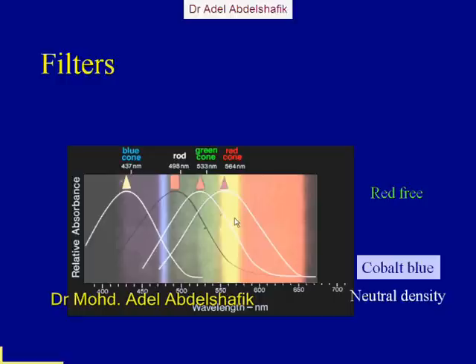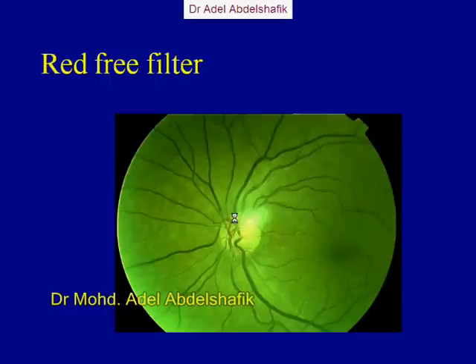We've learned that if you stay in a garden and you start to see the colors of the plants and flowers while the sun is going away, then the colors change when the amount of illumination is less. Things like a red rose, just before absence of light, will be brownish or dark. So this is the same. If you minimize the illumination of a slit lamp, the colors you'll see are not the same. It's not the natural thing. But if you put a neutral density filter, you get the whole spectrum and the colors are the same, but the amount of illumination is less. This is the value of the neutral density filter.